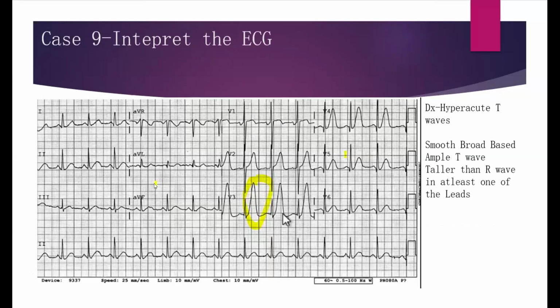Hyperkalemia generally does not localize. It does not go inferior, it does not go anterior wall MI and so on. You'll have hyperkalemia in contiguous leads, all of them, but you will not have localization in terms of blood supply. For hyperacute T waves, you can have early localization, because these hyperacute T waves later on will become an ST elevation. So for hyperkalemia, it might not localize, but remember, you can get hyperkalemia, tall tented T waves in some leads only. You can get it in the anterior leads.